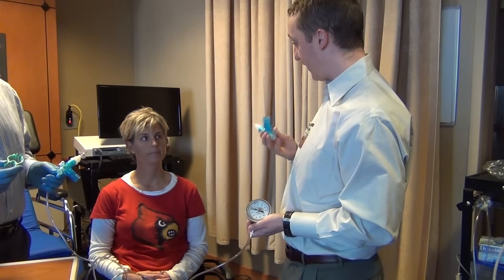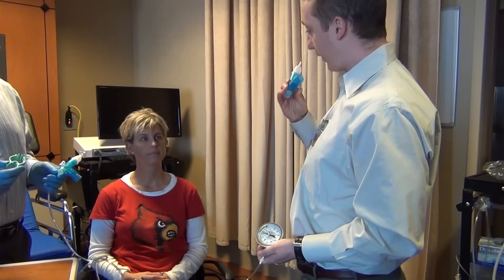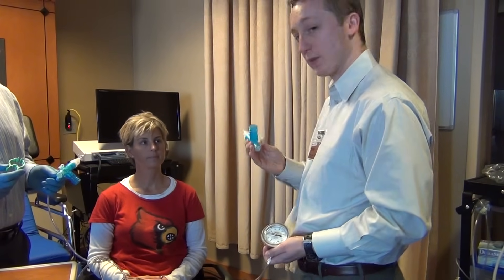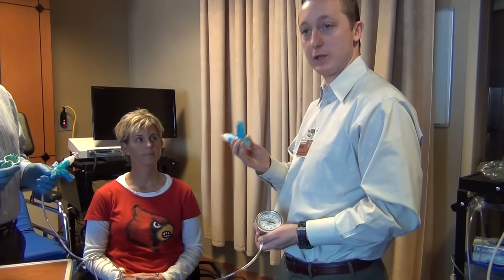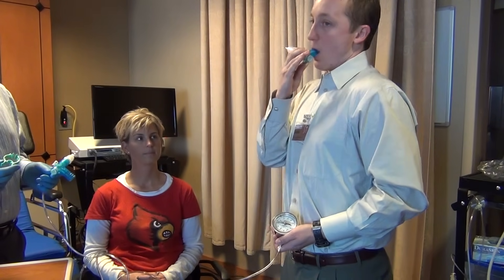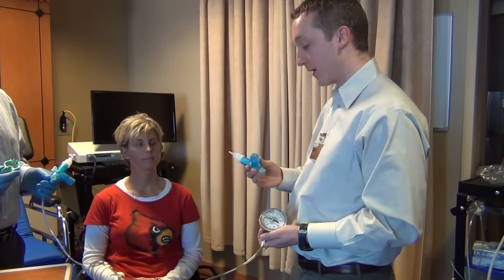What you're going to do is take a full breath in through this device and then blow out as hard as you can. The trick here is to listen for when there's no more air coming in — that's when you know the lungs are full. At that point, when you don't hear any more air coming in, that's when you ask them to blow out as hard as they can.